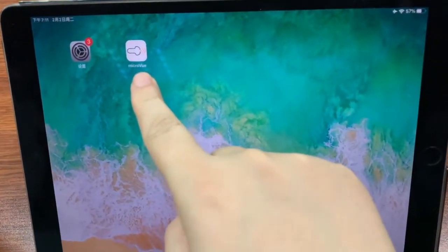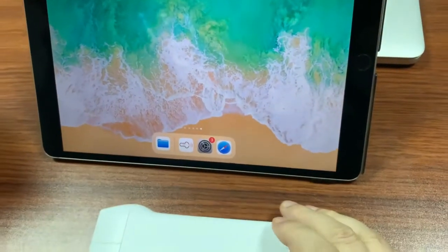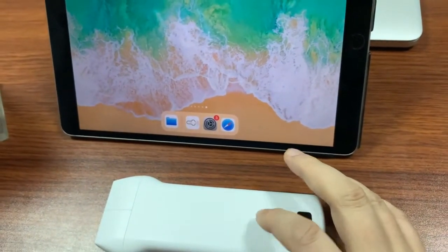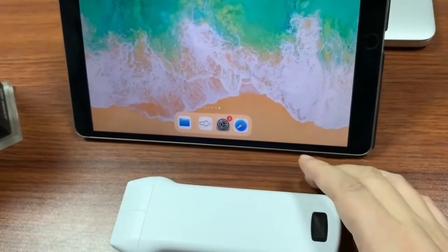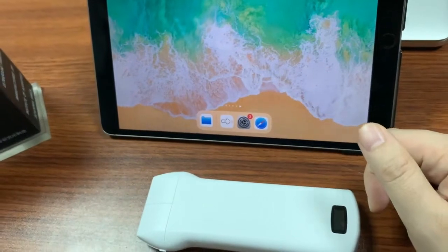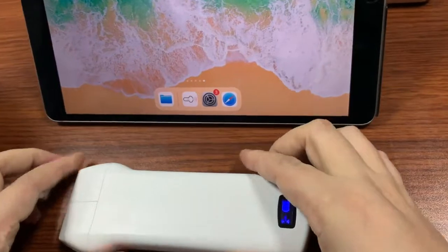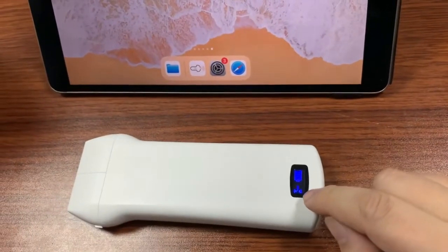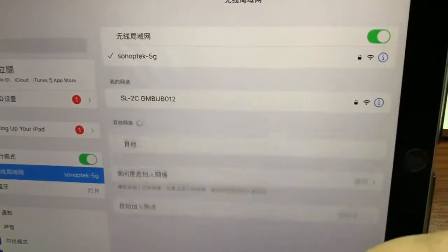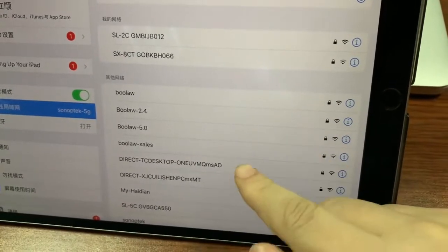The application MicroView is working together with the wireless ultrasound probe. The probe is working at this access point and the iPad can connect to this probe. First, we turn on the probe. When the wireless signal is blinking, we can connect the iPad to the probe.